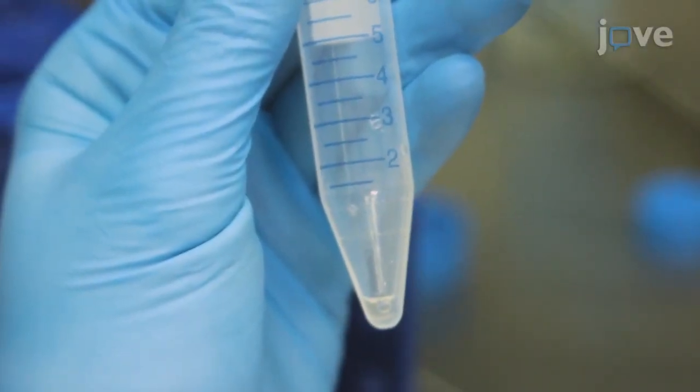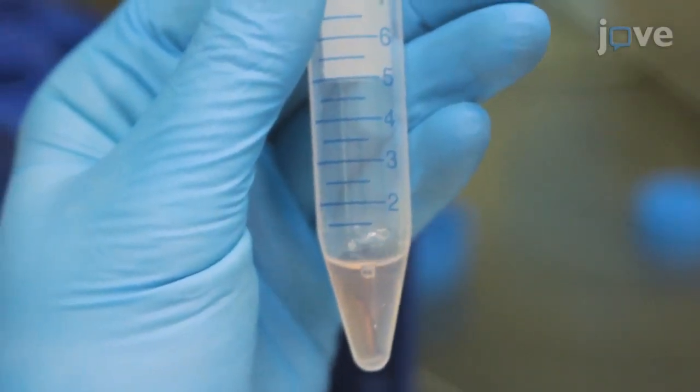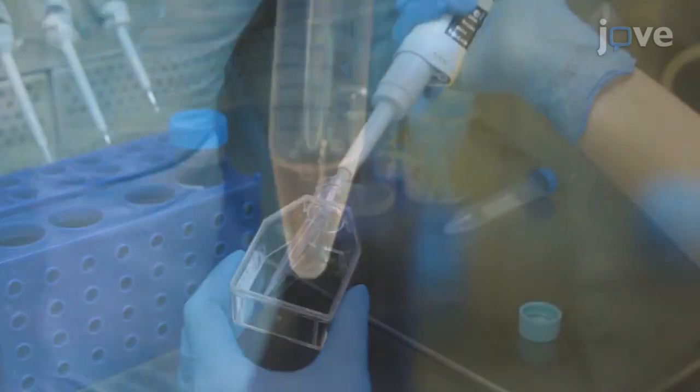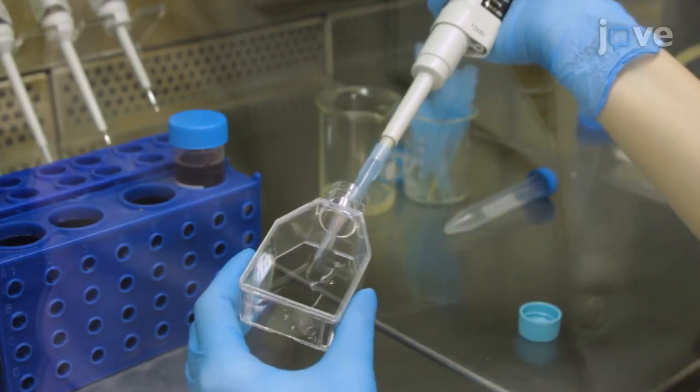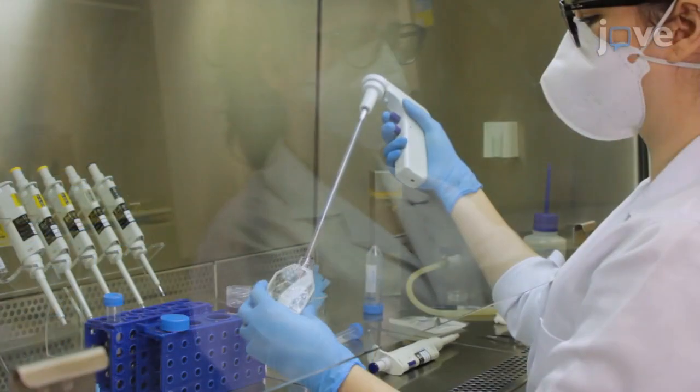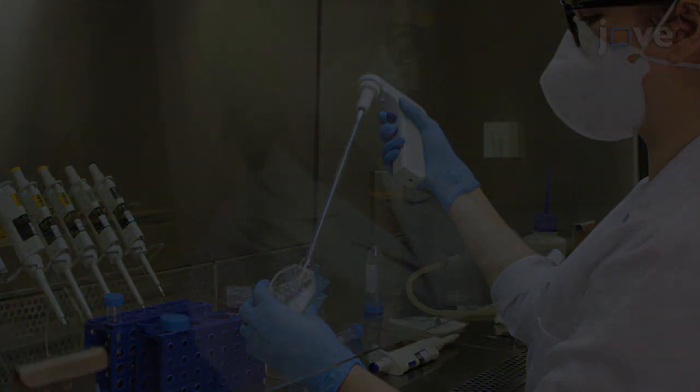After discarding the supernatant, suspend the cell pellet in 1 ml of astrocyte culture medium. Transfer the cell suspension to a T25 culture flask and make up total medium volume of 4.5 ml.